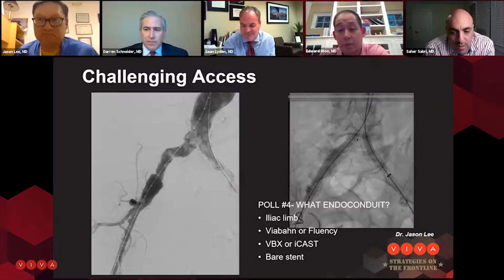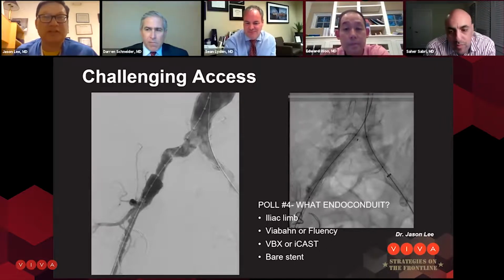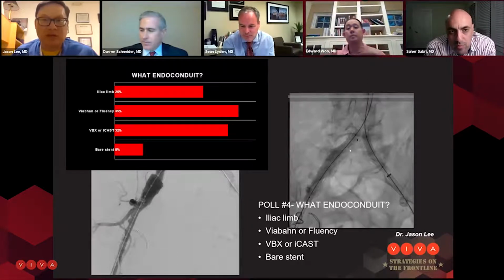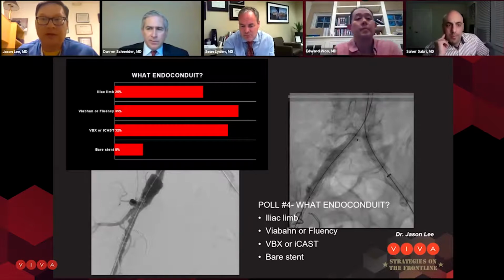Not excited about it, I'll say, because you're going to go up into that supraceliac region for a celiac. Oh yeah, look at that, all over too. So we've liked these limbs. Actually, this one was the 7 centimeter long limb that you get from the hypogastric from the Gore IBE device, which gives you a fighting chance of trying potentially to preserve the hypo. Turned out here, this right at the bifurcation here was too calcified, and anything to try to deliver past that was going to break on the way up or on the way down. So we decided not to risk it, and knowing we might need to do that, placed a drain preoperatively, thinking just like Ed had mentioned that we were going to go higher up on this.